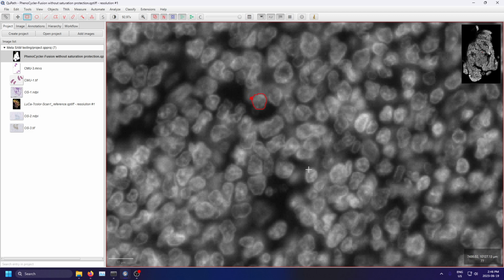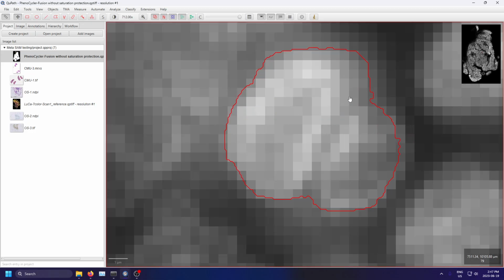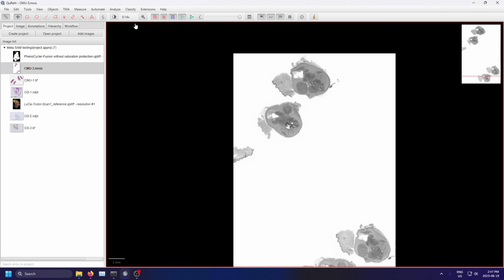Nice. Not perfect, but this is a great way to label your own images if you wanted to train the model yourself. In the past, you used something like a wand tool and kind of relied on intrinsic, real-time edge detection, which is never really perfect. But in this particular case, you can just draw a square around your nuclei. Now, it might not do a good job of segmenting two separate nuclei, but this is a faster way of labeling your data set. Another common request is detecting tissue.